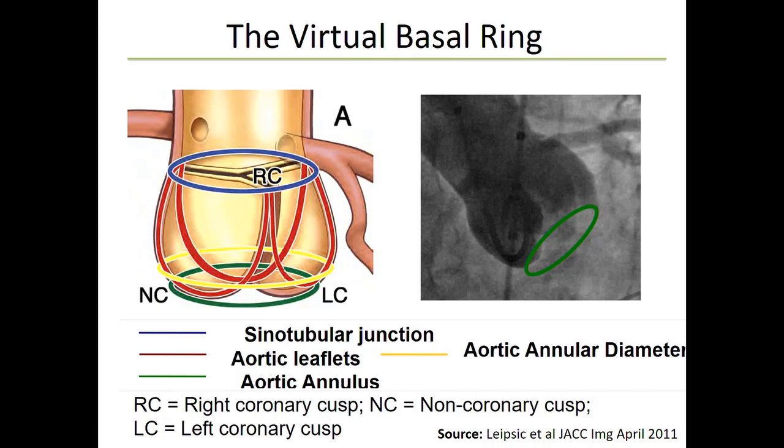We focus on this concept of oversizing, putting in a valve larger than the annulus itself to prevent paravalvular regurgitation, but not too large. But if you talk to the engineers, they'll say that's such a physician-focused way of looking at it. Because how did we define the sizing algorithms? We looked at those patients that had complications and looked at what their sizing was. And what we realized is that if you undersized a balloon expandable valve, you put in a valve smaller than the annulus, 20% had moderate paravalvular regurgitation.